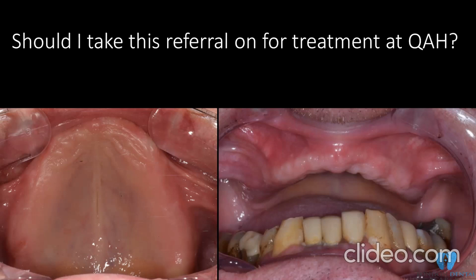Let alone the fact that when you have these teeth on one arch, the stability of the denture would be compromised, and the retention as well might be compromised, because once these teeth come into function, they will straight away work on the anterior region, especially with the guidance, breaking the seal from the posterior region, making it difficult for patients to retain their dentures. And as you can see, early guidance on the anterior teeth will definitely break the seal in the posterior dam zone, and also the vibrating line would no longer be in function in such cases.